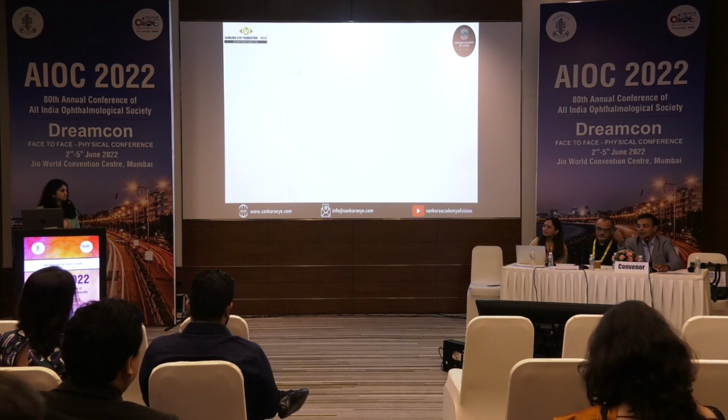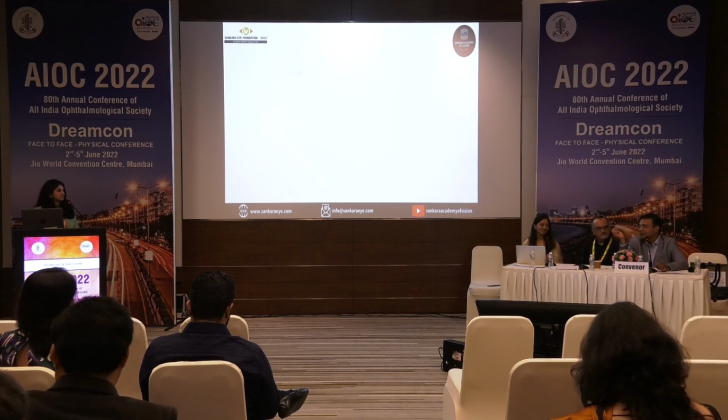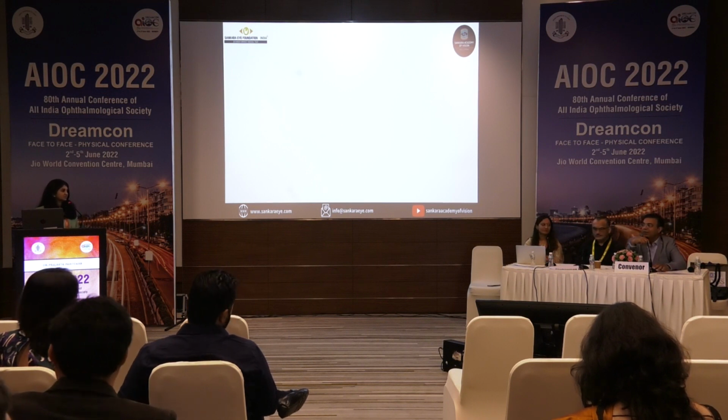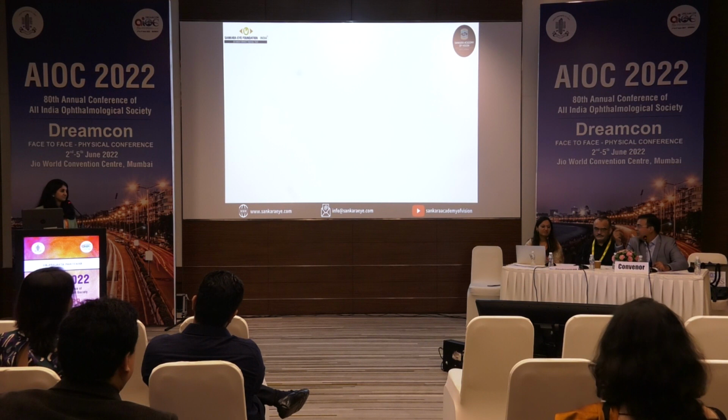But it's the same in the Pentacam also, it's repeated. Any subtle scarring or anything in that area? It's symmetrical in both eyes. That's a funny thing because sometimes you see it in one eye and you may have scars. It's repeated on the Pentacam also, and I have acquired the scans like 2-3 times. What about the epithelium maps in the second patient? You don't have access. It's posterior, sir. I know it's posterior, but it would be worthwhile seeing what's on the surface as well sometimes in that area.